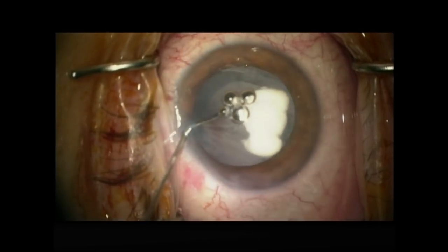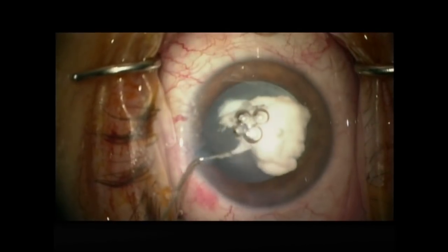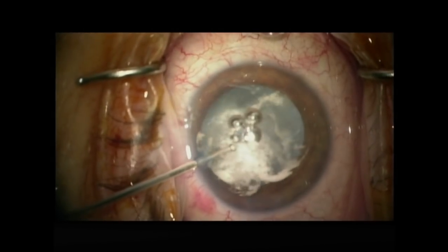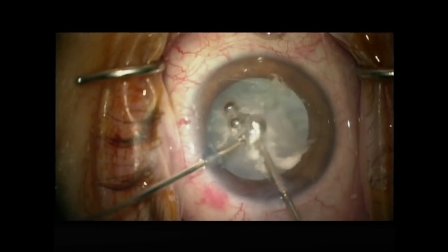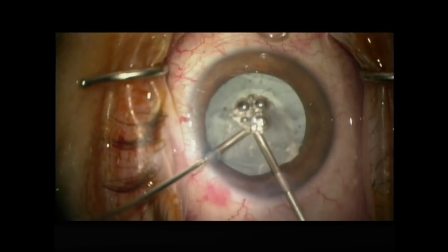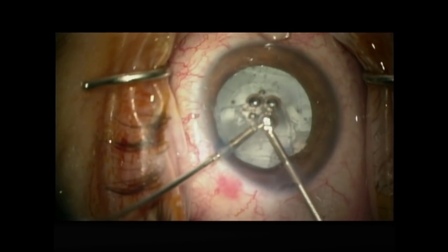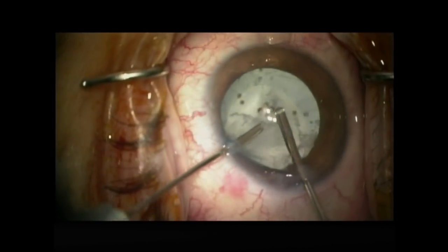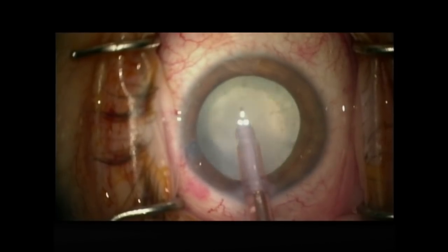Triesence was then used to look for any anterior vitreous material. However, this patient had had a previous pars plana vitrectomy and no vitreous was noted to be found in the anterior chamber. At this point, white cortical lens material was noted in the vitreous cavity.